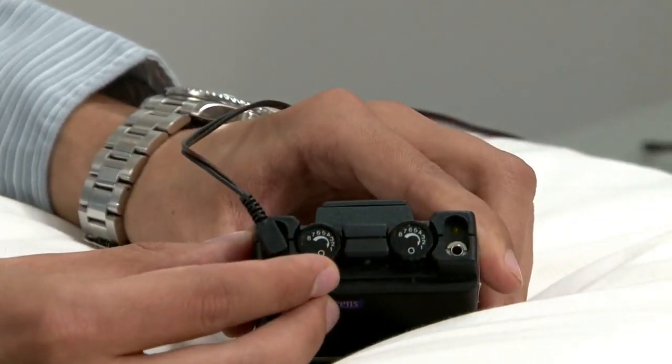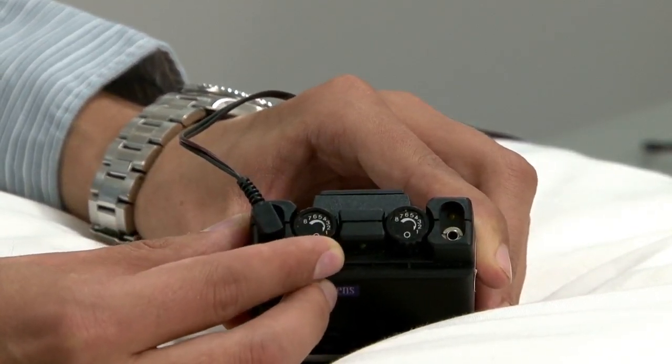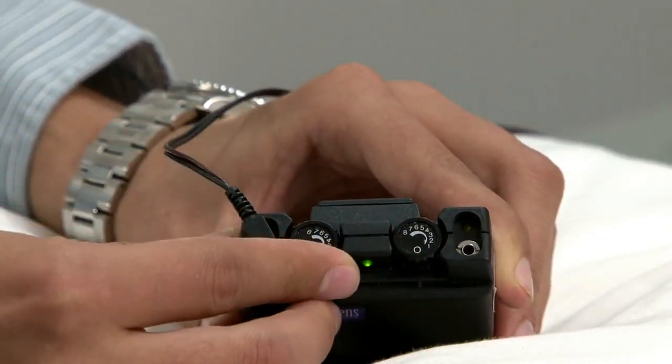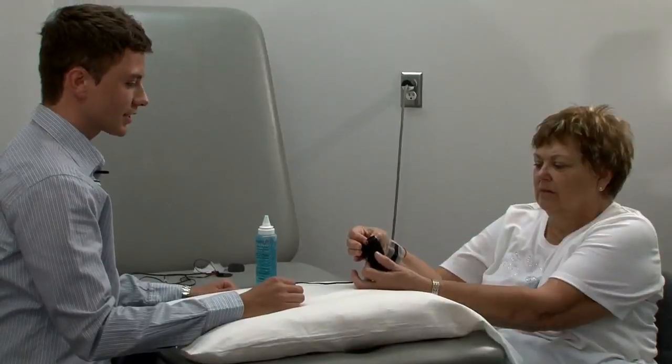Right up at the top you have your amplitude. This will adjust the power of the machine. You're supposed to feel a slight tingle once it's on. You shouldn't feel any pain or discomfort. Adjust it until it's comfortable.